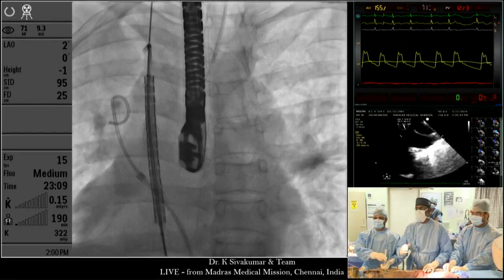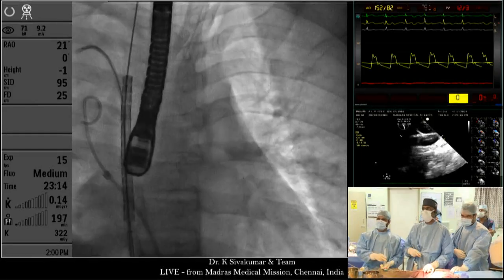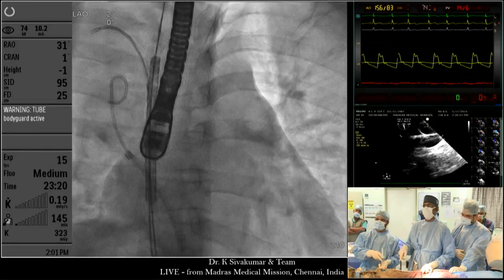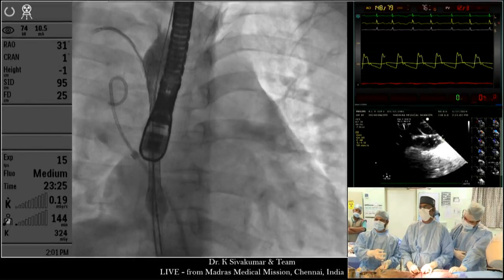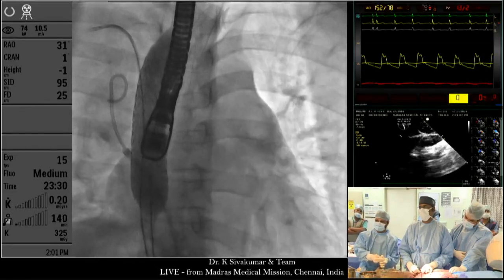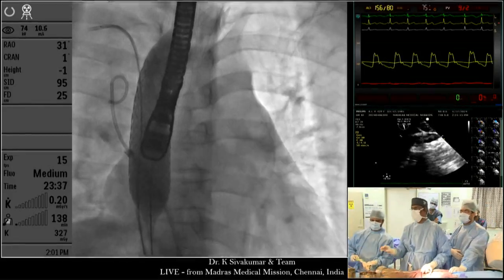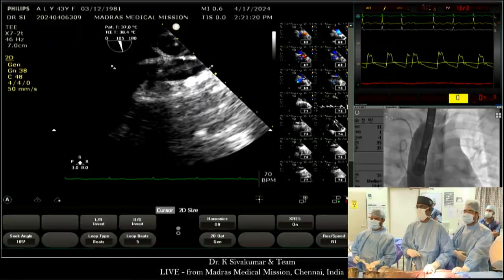Now a little RAO so that we see the difference. That's fine. Okay, now you are ready. Now Pramod is going to inflate. Keep inflating. Go to around 3 atmospheres. Tejasvi, now make the transesophageal bigger. Transesophageal bigger, and now show the color flow.